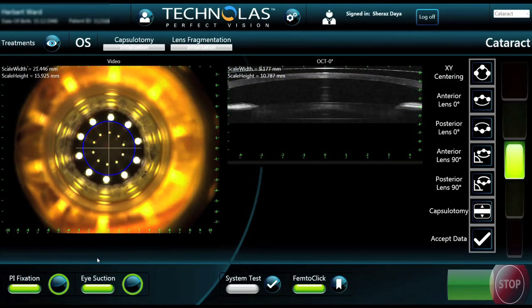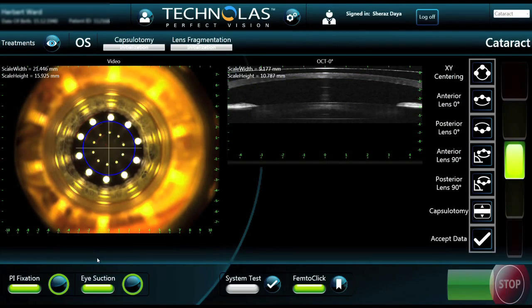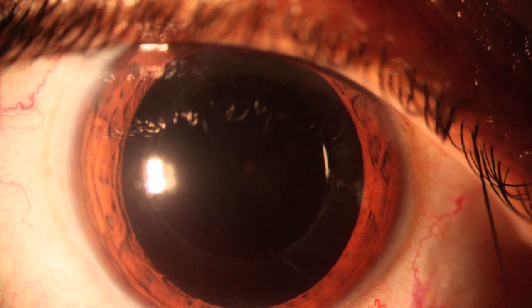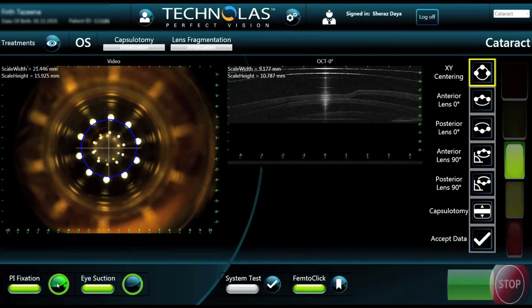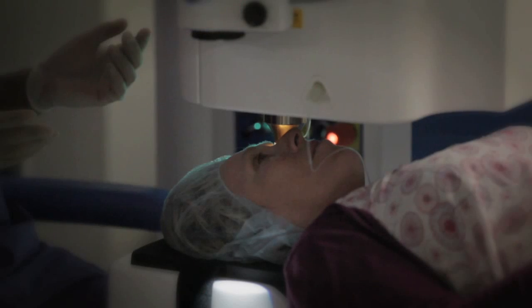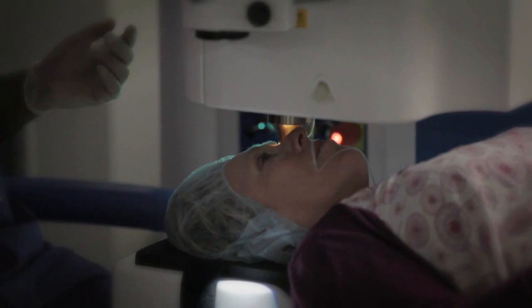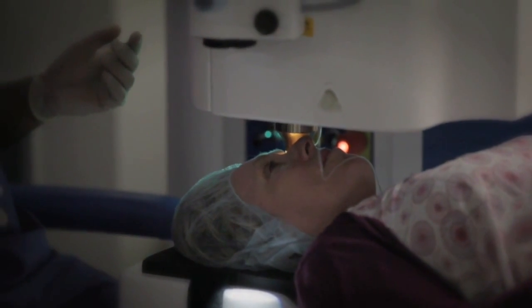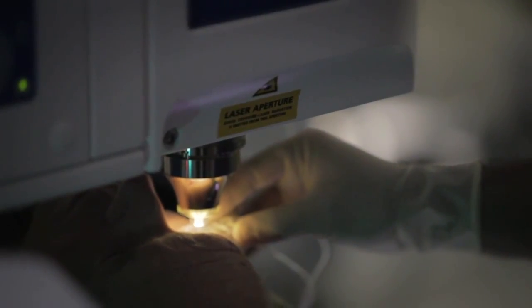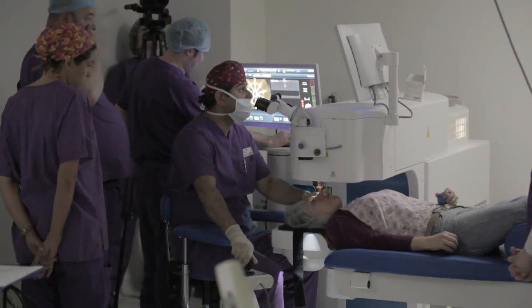Femtosecond laser cataract surgery is in its relative infancy. Perfect capsulotomies are performed with excellent lens centration. Newer techniques will inevitably evolve to maximize the benefit that this technology has to offer. Translenticular hydrodissection is one such technique that reproducibly and reliably facilitates lens removal.